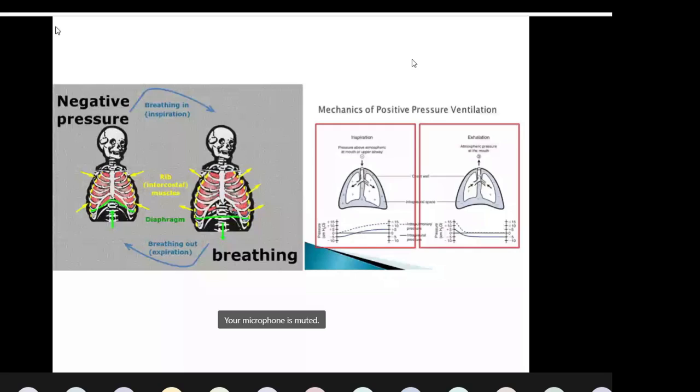And at the end, it can give PEEP. PEEP is what would improve oxygenation next to FiO2. You can increase FiO2 to a certain extent, but after 100% you can't increase FiO2. And then what next is the amount of time the air in the lung is in contact with the epithelium and the blood. The more that amount of time, the more that the oxygen transfer occurs. So the more oxygenation you can achieve. So that's what you can achieve by mechanical ventilation.